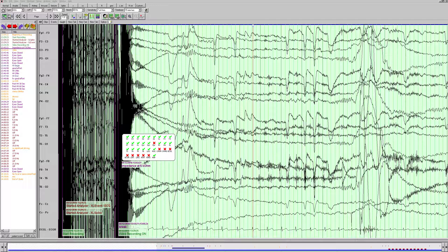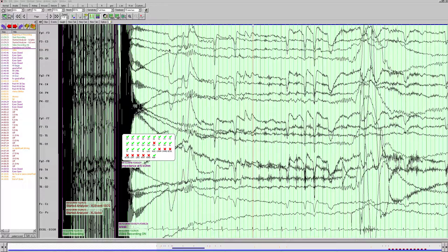When we first start looking, we want to orient ourselves and make sure we understand what montage we're looking at. We can see this is the left parasagittal chain, the right parasagittal, the left and right temporal, and this is going down the vertex — so this is a double banana montage. Over here on the left are the technicians' comments, and up here we can see we're at our regular settings. The filters are between 1 and 70 hertz, we've got our notch filter on, and we're at our standard sensitivity and time bases.